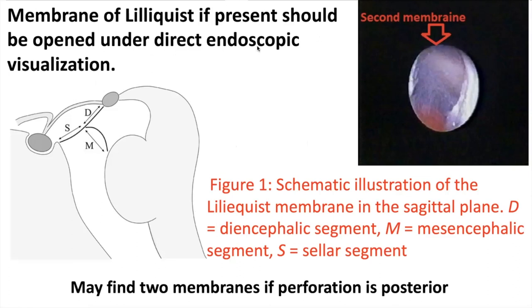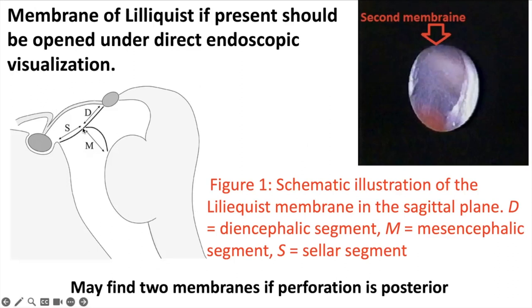The Liliequist membrane, if present, should be opened under direct endoscopic visualization. One should know its parts: it has a sellar segment, diencephalic segment, and mesencephalic segment. If the perforation is made posteriorly, one may encounter two membranes — the diencephalic and mesencephalic segments. If the perforation is made a little anteriorly, only one segment will be encountered.